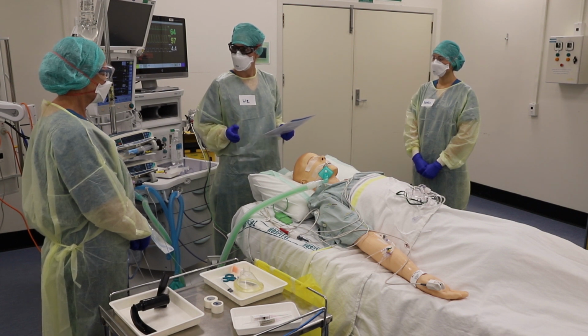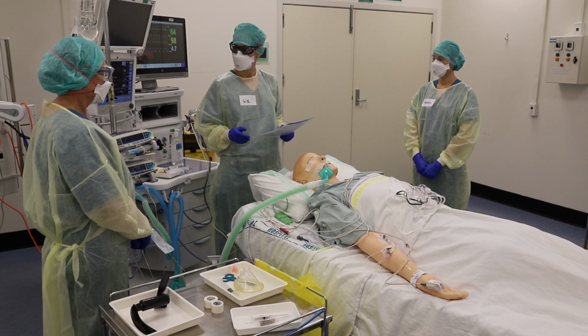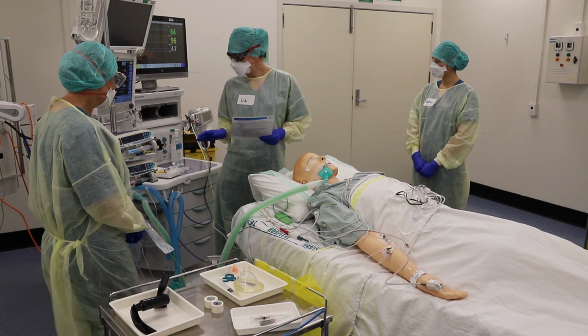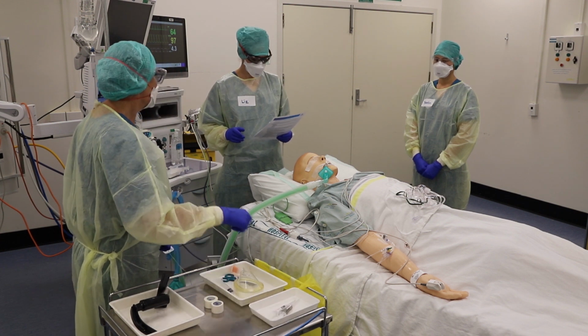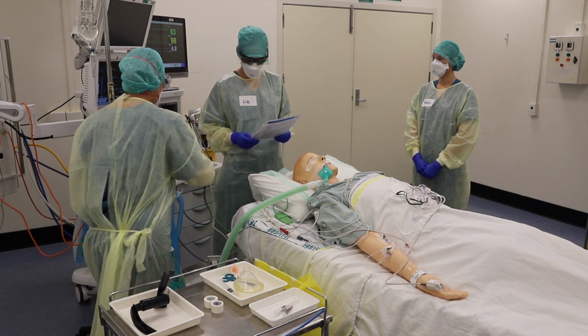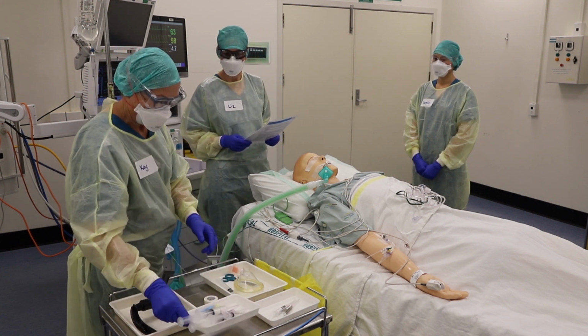We'll regroup and talk about what our plan will be to decide if the patient's suitable to extubate or not at that point. I do have some drugs drawn up here for reintubation and for emergencies, but if we've got any concern that this patient won't extubate smoothly, we won't extubate him. And there's a bunch of them over here, and if you just instruct me what you want to get at the time. That's a good idea.